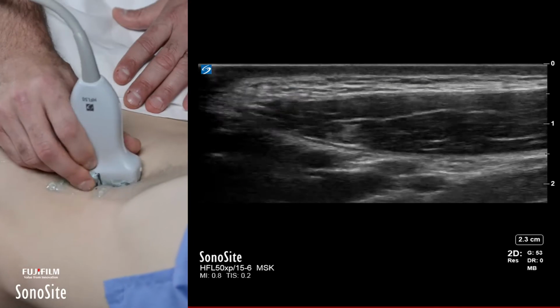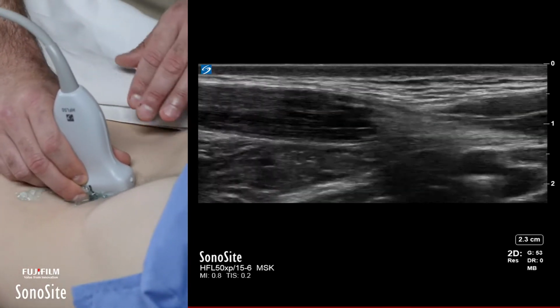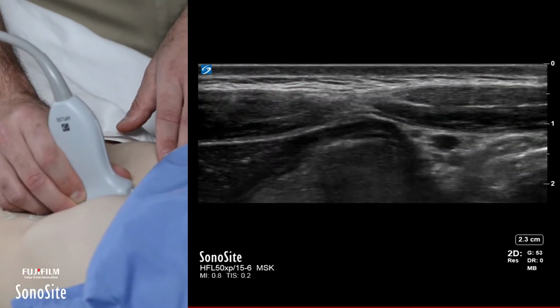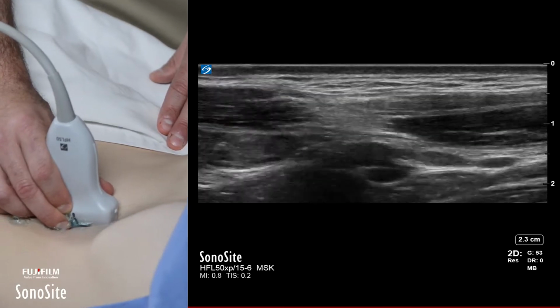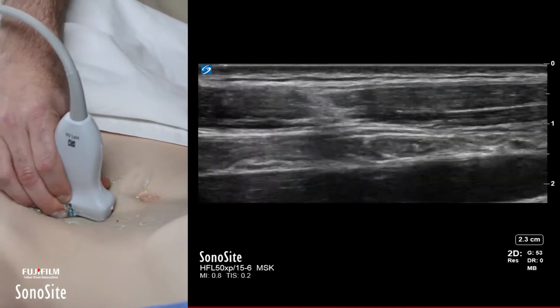Now I'm going to rotate again. So now I'm on the long axis and I can see that interdigitation. And if I track that, I can go all the way up and see where the rectus abdominis muscle attaches to the ribs. I'm seeing the interdigitations there. So there's multiple interdigitations, and those interdigitations are what give the characteristic six-pack appearance of the rectus abdominis musculature.